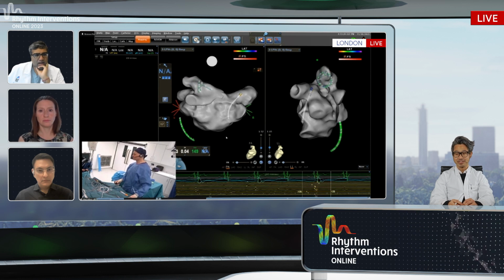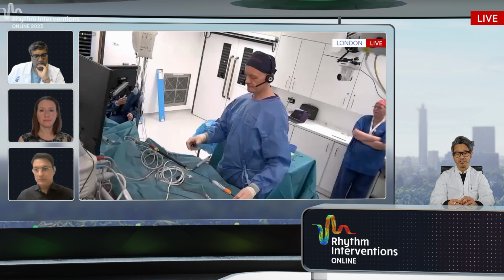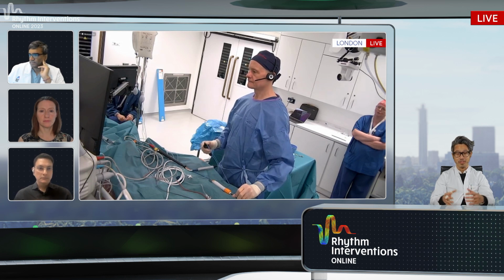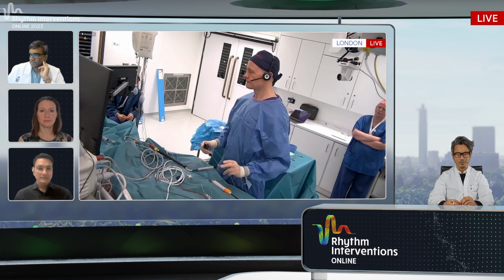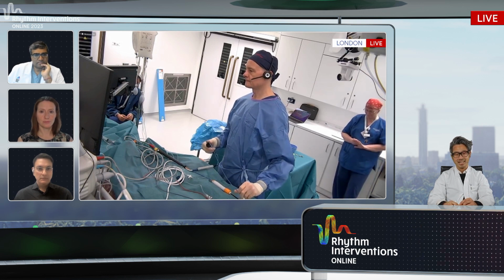Maybe if I can ask for our audience also just a very principled question in the very beginning. Of course, it was beautiful to see how you managed to go over without any fluoro, and I do envy you with not being in need of wearing lead in the EP lab. That's amazing and great. But what would you do typically?